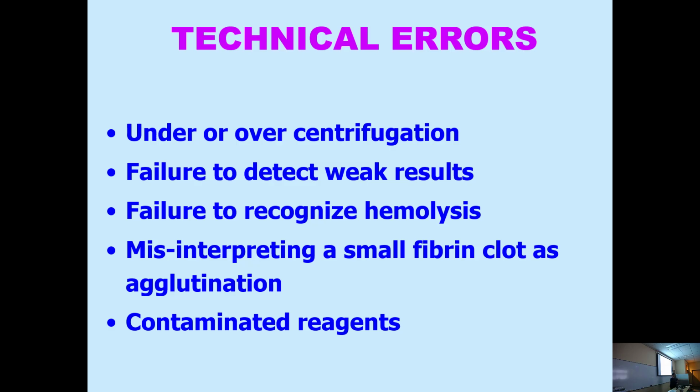Those slight hemolyses, something like that. I don't know how to say it. Slight hemolysis is a significant reaction, so you've got to make sure to recognize that.